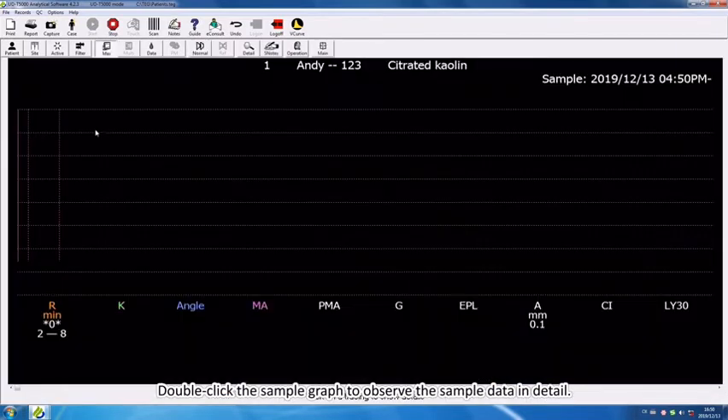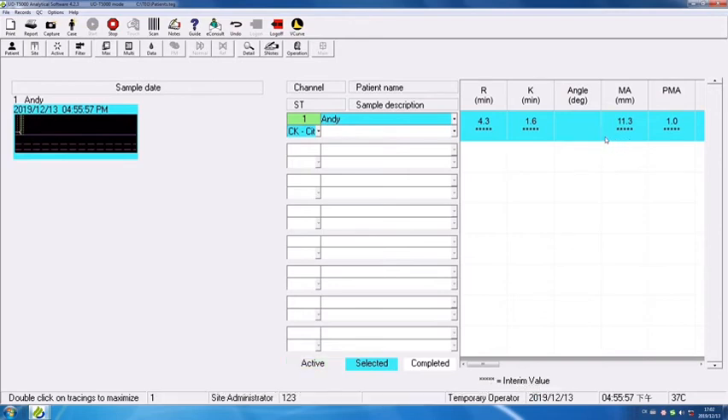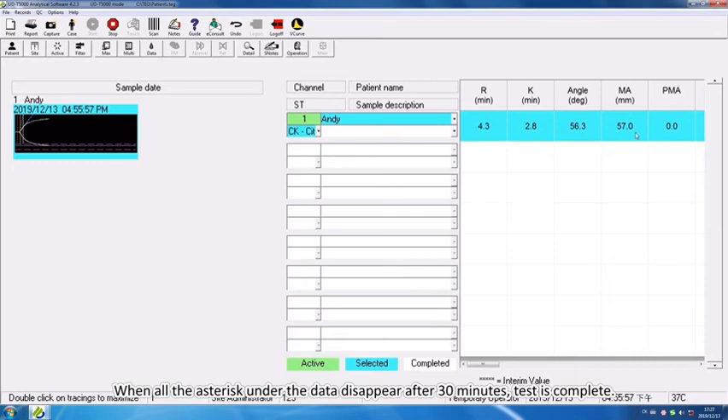Double-click the sample graph to observe the sample data in detail. When all the asterisks under the data disappear after 30 minutes, the test is complete.